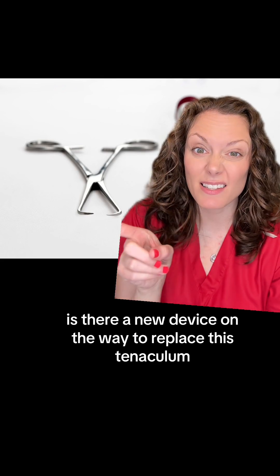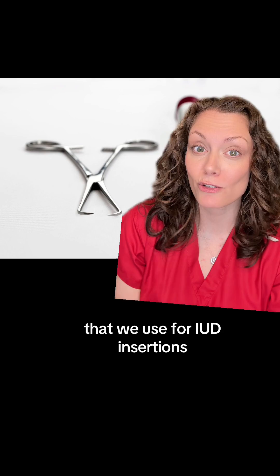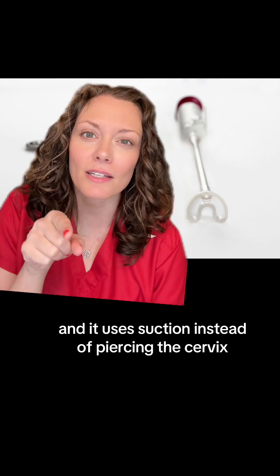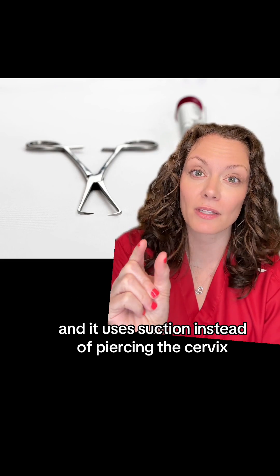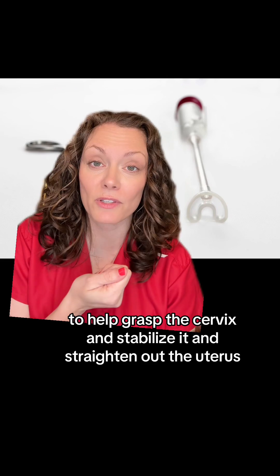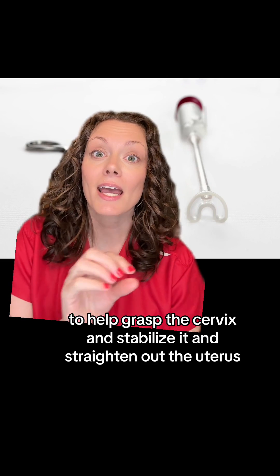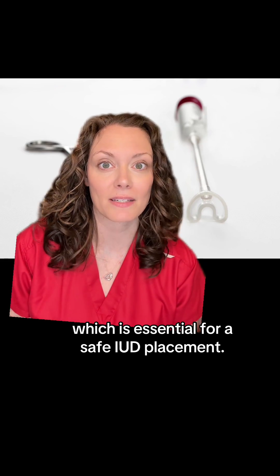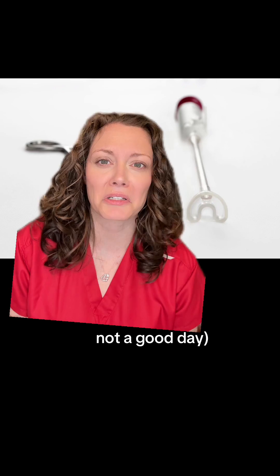Is there a new device on the way to replace the tenaculum that we use for IUD insertions and other GYN procedures? This thing might do it. It's called the CareVix, and it uses suction instead of piercing the cervix to grasp and stabilize it and straighten out the uterus — which is essential for safe IUD placement. Otherwise you could poke a hole in the uterus, not a good day.